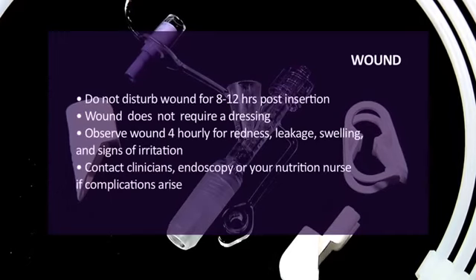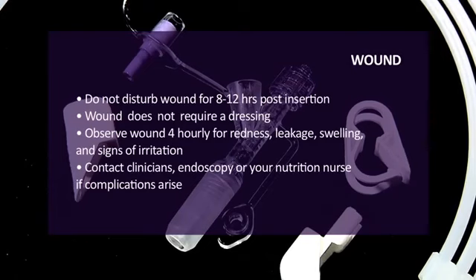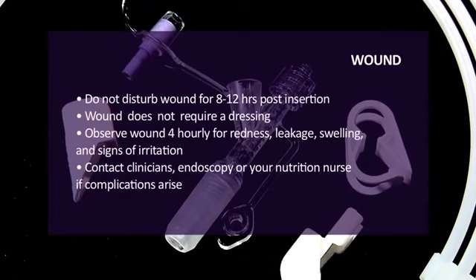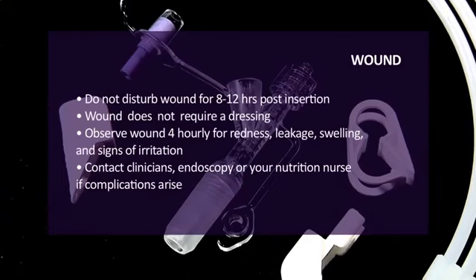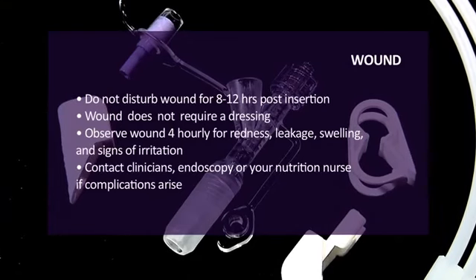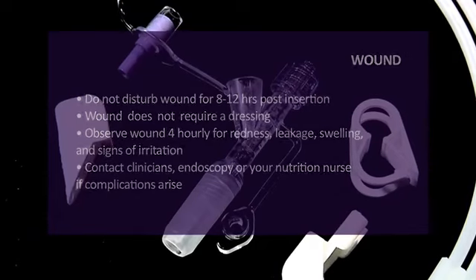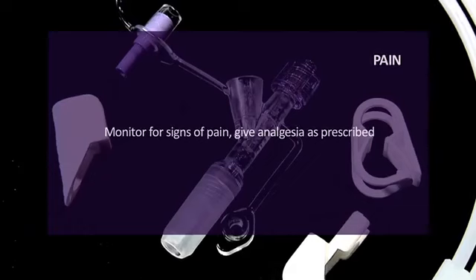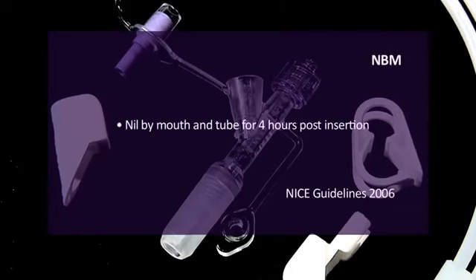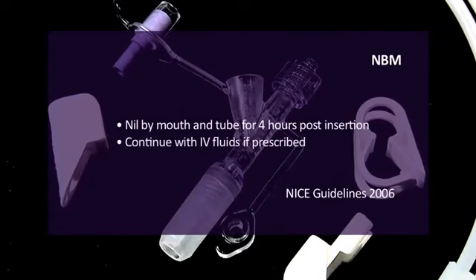Don't disturb the wound for 8 to 12 hours post-insertion. The wound does not require a dressing. Observe the wound 4 hourly for redness, leakage, swelling, and signs of irritation. Contact clinicians, endoscopy, or your nutrition nurse if complications do arise. Monitor for signs of pain. Give analgesia as prescribed. Keep nil by mouth and tube for 4 hours post-insertion, and continue with IV fluids if prescribed.